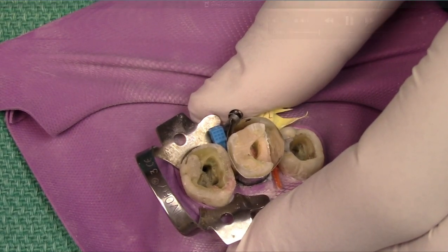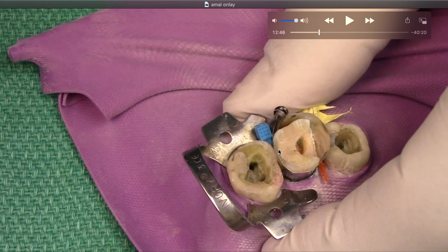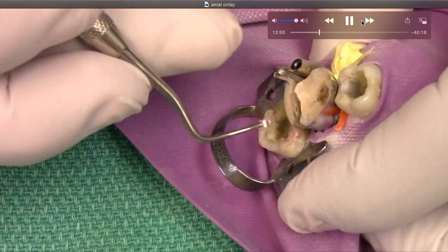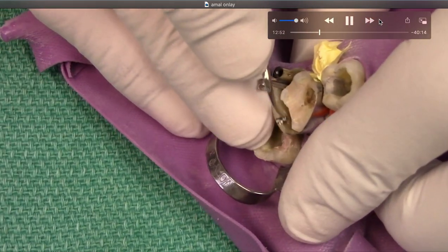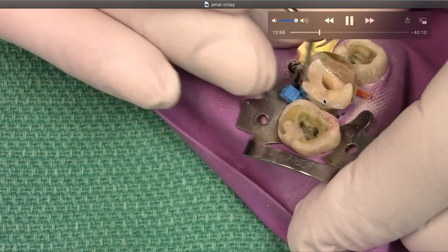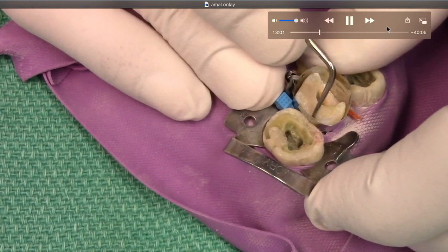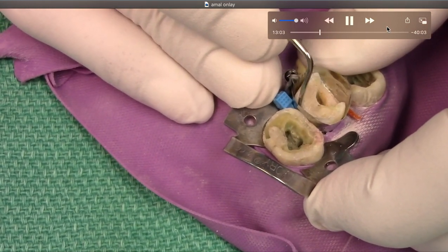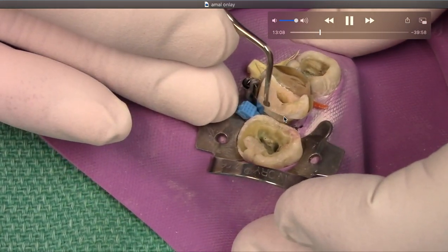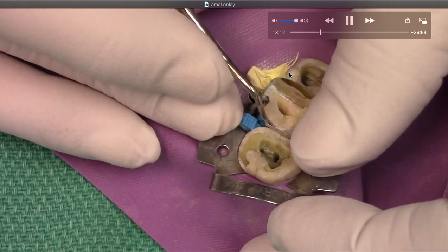What you just saw is this old-school burnisher — I couldn't fit it in there because the ball is bigger than the 0.8 millimeter space. One of the captains watching said 'you should use the spoon,' and I thought that's a great idea. So I'm using the spoon because the contact is pretty tiny. I'm slowly extracting the tooth out of the plastic as we do this. We burnish that, and then I notice I'm opening the contact and the gingival box, so I'm going to re-pack the Teflon.